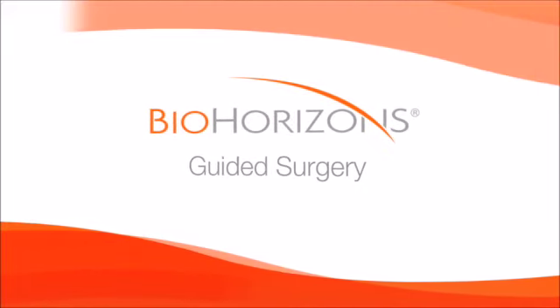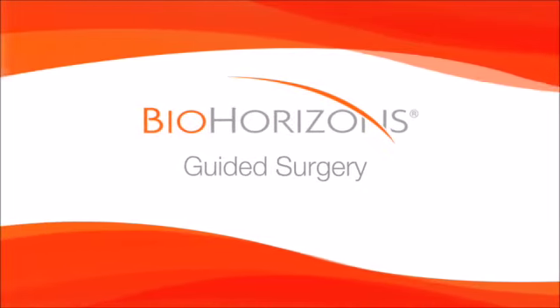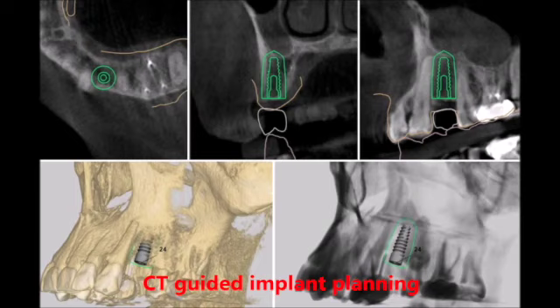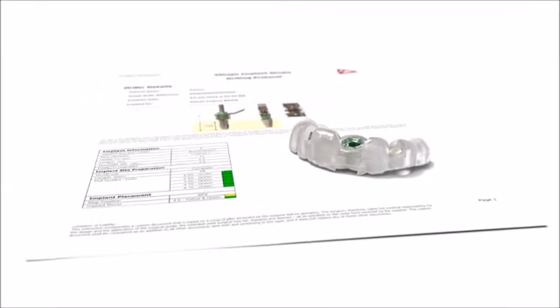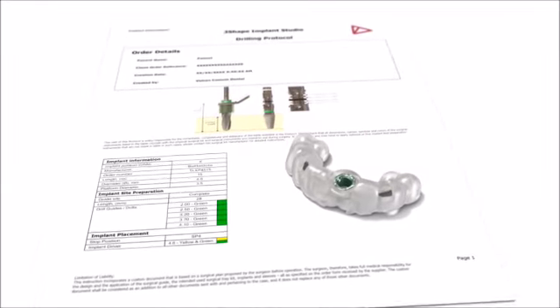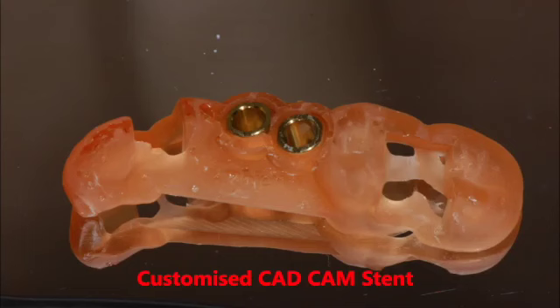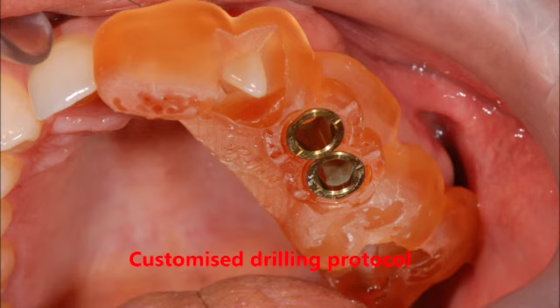Herein we show you the BioHorizons guided surgery protocol, where a patient's CT scan is loaded onto a specialized software and we can actually see where we place our implants. This plan is then exported via email to your laboratory, and the dentist gets a CAD CAM stent as per the patient's computerized tomographic scan.